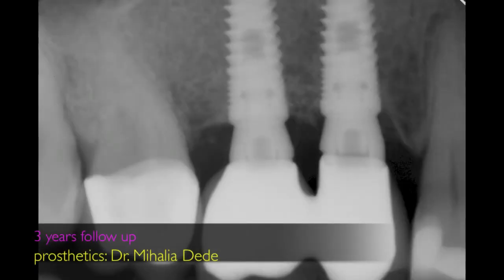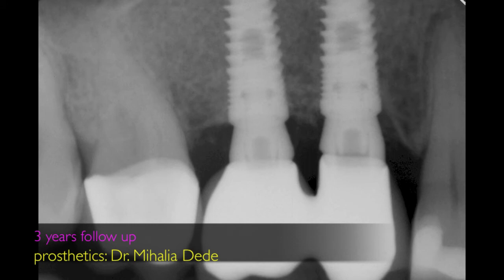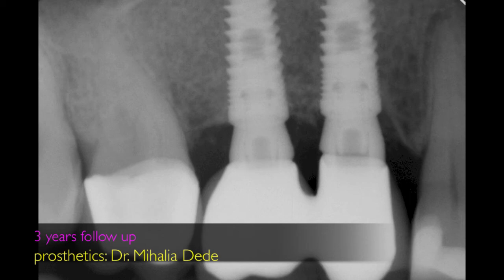This is the x-ray of the patient three years post prosthetic treatment, where you can observe good interproximal bone stability around the implants.